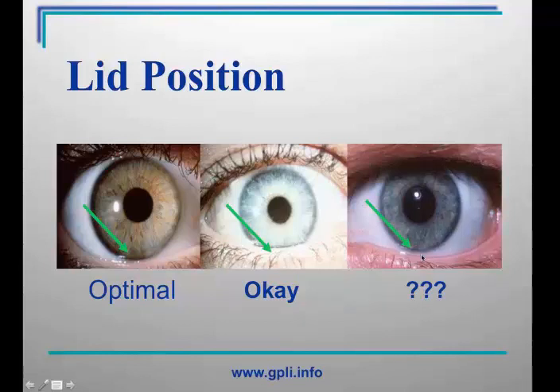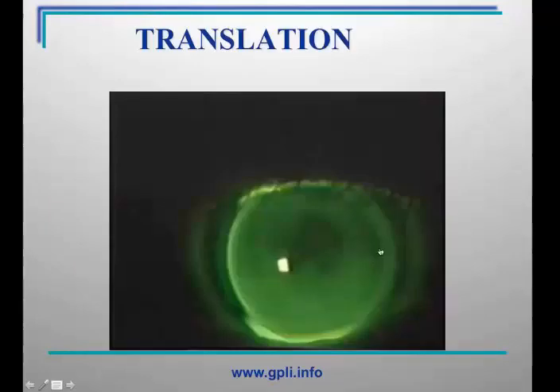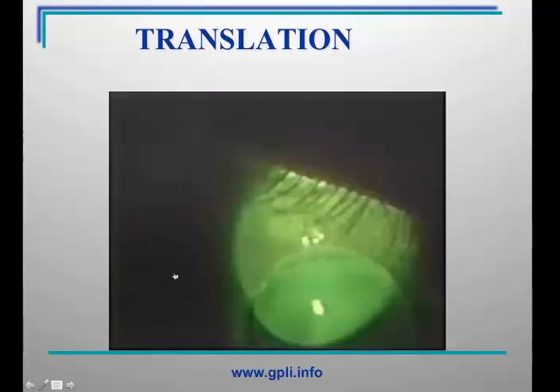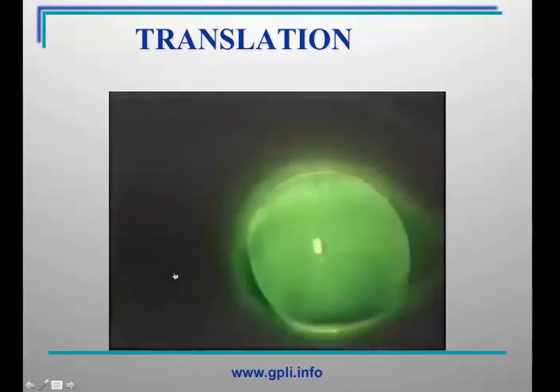And speaking of translation, here you see a good fit. This is a bifocal lens. Typically the trifocal designs will have the trifocal portion right into the lower pupil margin. This is a bifocal lens. The line is right at the lower pupil margin. And then we'll watch this lens. The patient looks down, you lift up the upper lid, and that lens should in fact translate, which means it gets pushed up. So now the patient is in fact viewing to the near part as they're reading.